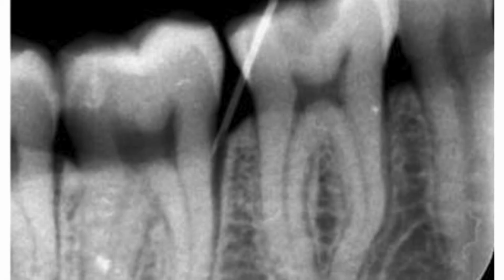And here you can see how the needle, you can go in that way. That's a little diagonal. Most of the ones I've observed insert the needle penetrating into the periodontal ligament more in line, parallel with the long axis of the tooth, than angled like that, but you could give it like that too.